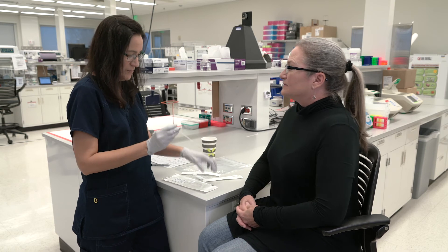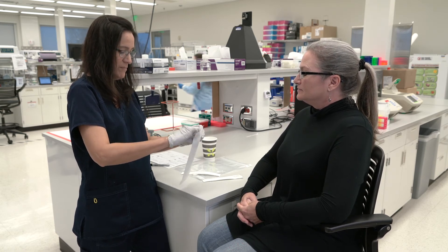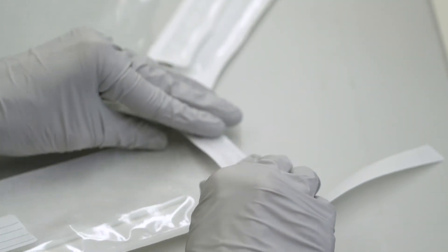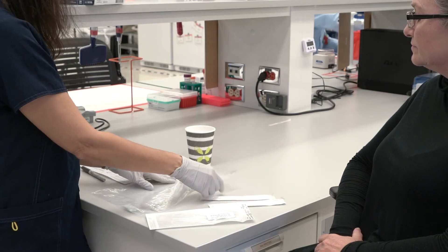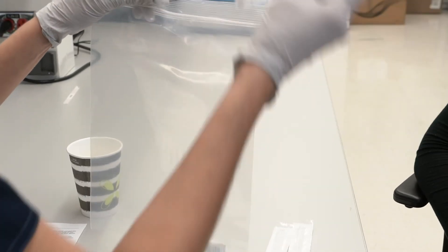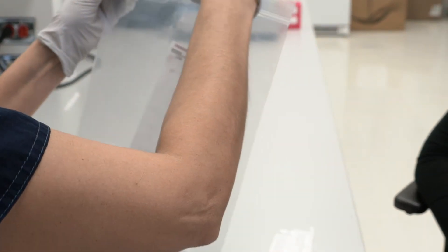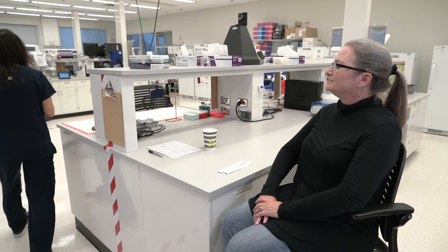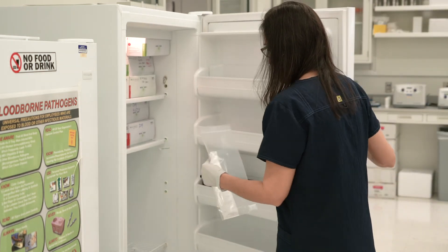Now place the second swab into the dry pack right next to the first one, DNA collection tip end first. Seal the dry pack by taking off the protective strip and pressing down the self-adhesive flap firmly to create a tight seal. Now place the dry pack into the large Ziploc bag along with the supplied desiccant pack. Enclose the sample, ensure the patient information is correct, and seal the bag. Store the sample in a secure refrigerator sample storage area until ready to send into the lab for testing.